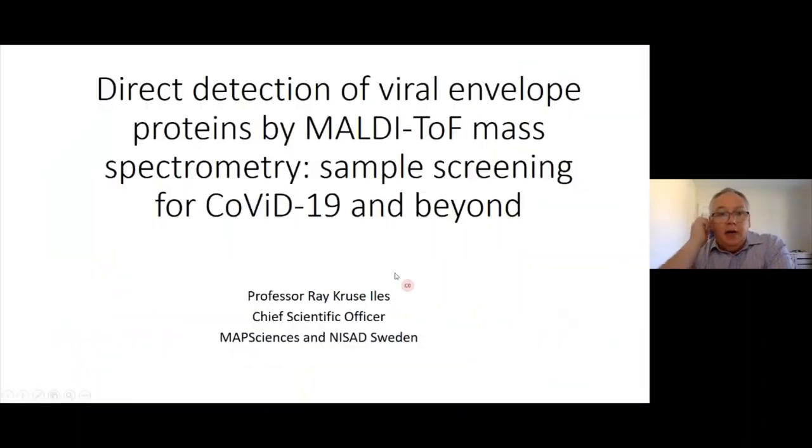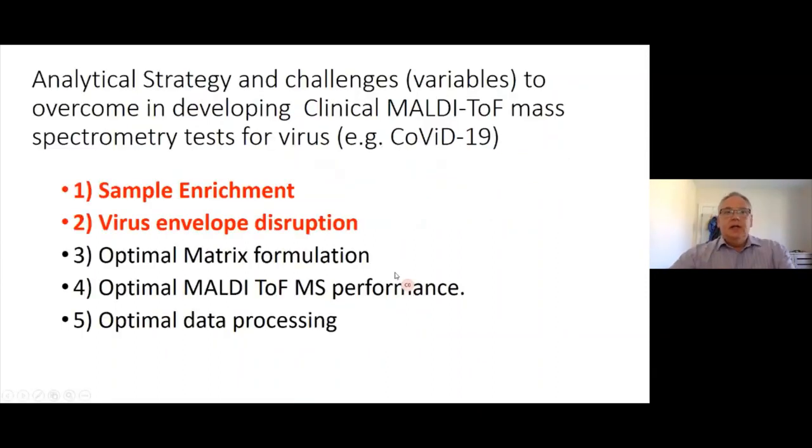There we go. Right, I'm just going to get straight on to the subject in hand. For about 6 years now, we've been trying to, or in fact, successfully moving the use of MALDI-ToF as a research tool into the clinical arena. And all of you who are familiar with mass spectrometry know that there are a number of challenges or variables that have to be overcome.